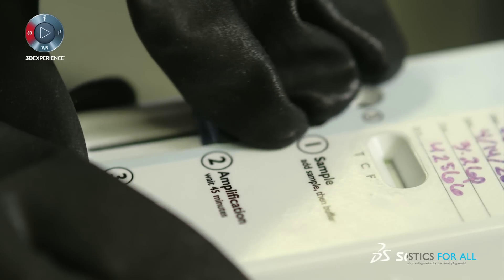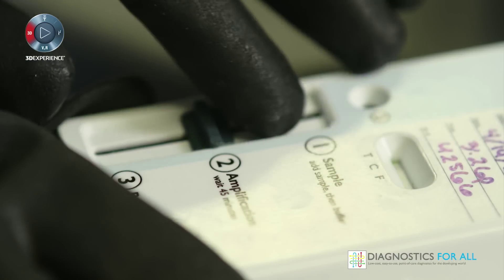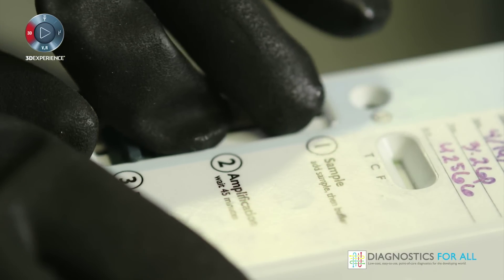We then slide this wet piece of paper that contains the genetic information of the virus to the amplification zone. That act of sliding turns on a heater. The amplification step is important because it provides more copies — like a photocopy machine, but for DNA. When we slide to the third and final zone of the device, it allows us to wash all of those new amplified copies out onto what's called the lateral flow strips that will give us lines if the patient is infected with Ebola or not. That readout is very similar to a home pregnancy test.